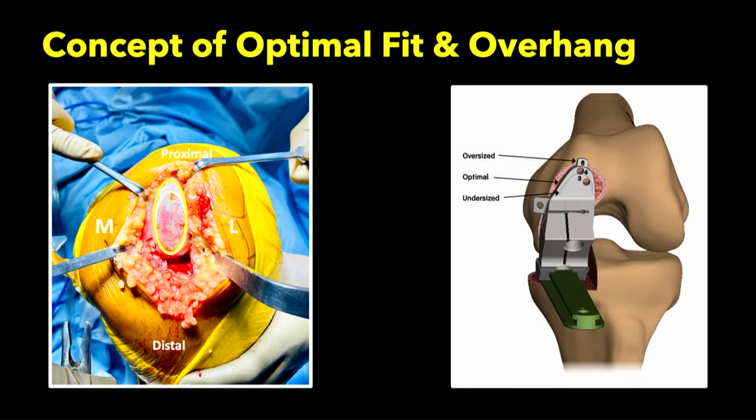On the other hand, in scenario 2, if you have anterior overcoverage, that would lead to patellofemoral stuffing and increased anterior knee pain. The third scenario, which is the lesser of the 2 previous devils, is undercoverage, where this part of the eroded cartilage is not covered, and that would cause reduction in prevention of knee pain.